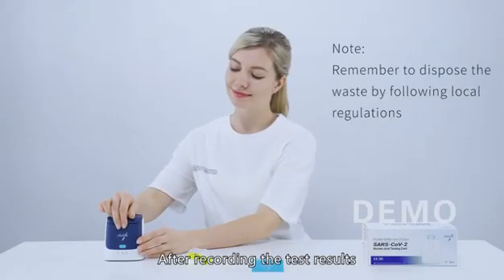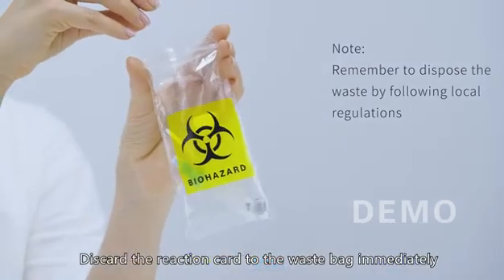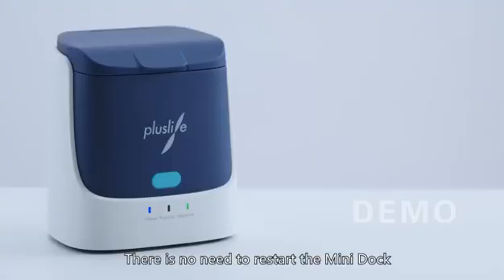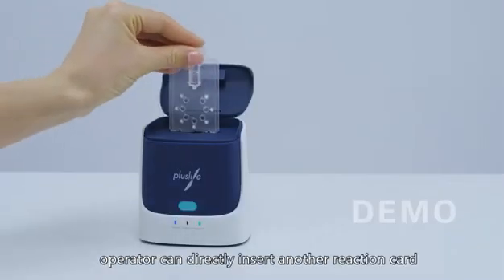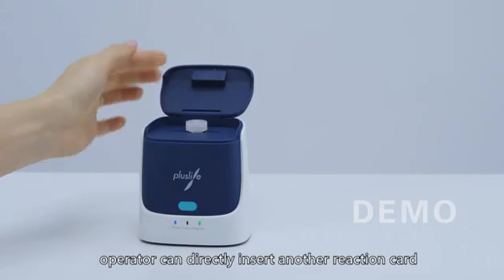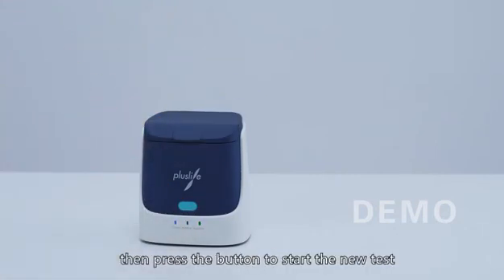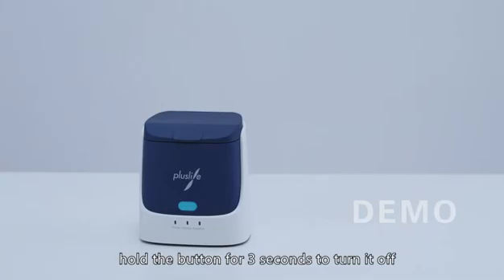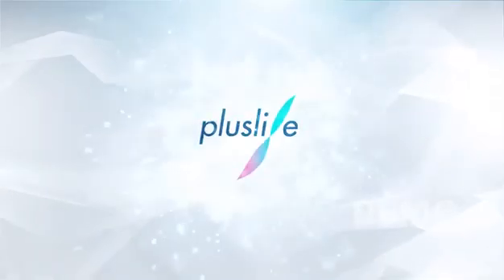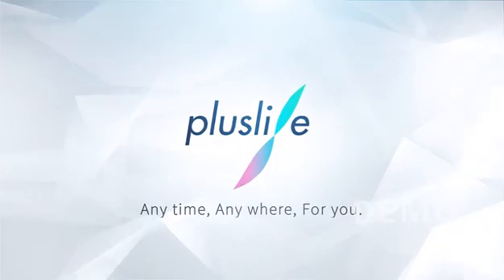After recording the test results, discard the reaction card into the waste bag immediately. There is no need to restart the mini dock if an additional test is required — the operator can directly insert another reaction card, close the upper cover, and press the button to start a new test. If the operator needs to shut the device down, hold the button for 3 seconds to turn it off.